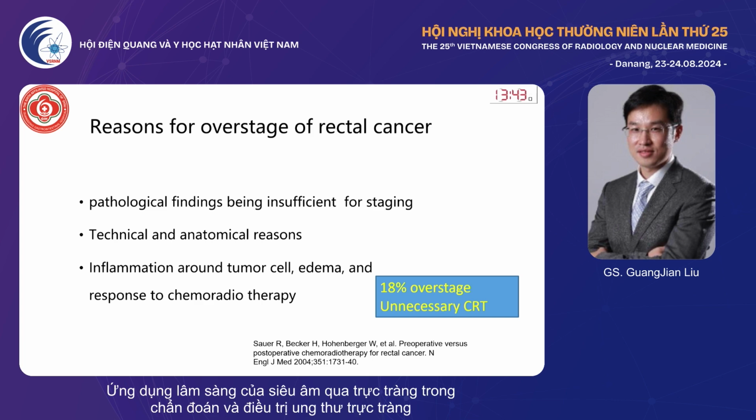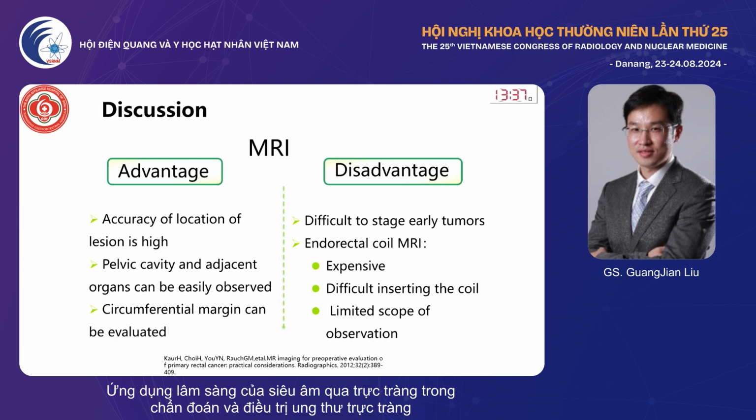So sometimes we will also be influenced by the fecal matter in the rectum. With MRI, the advantage is that we can observe the whole rectal cancer and the surrounding tissue.